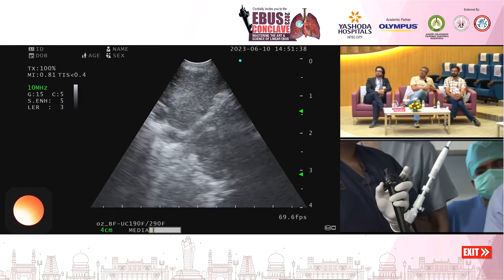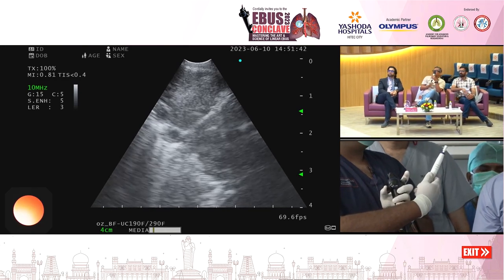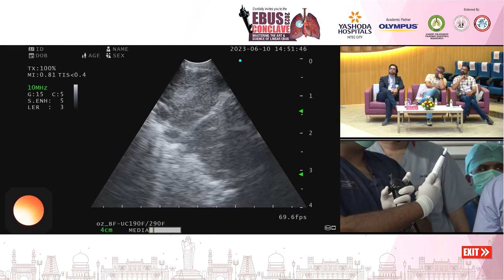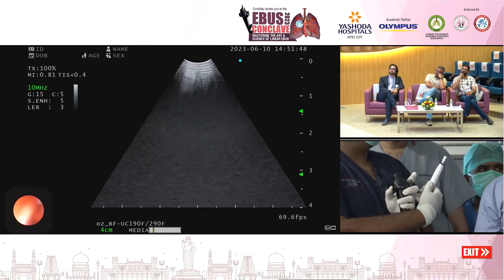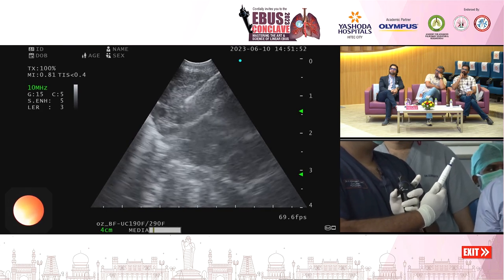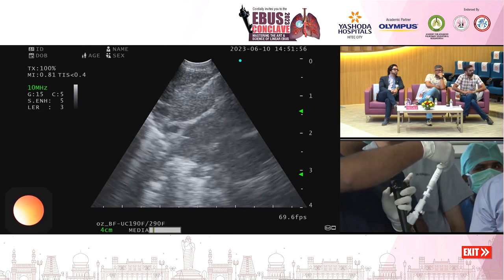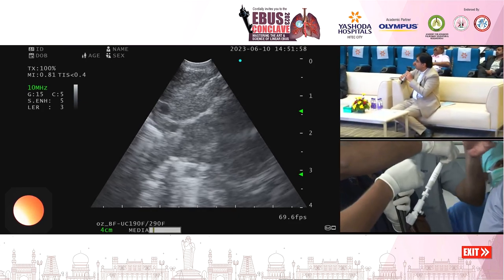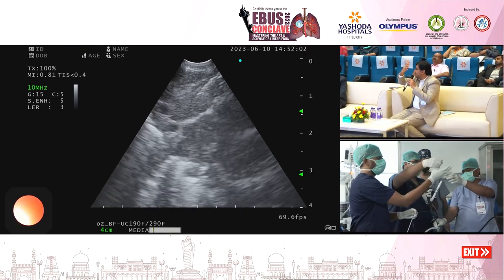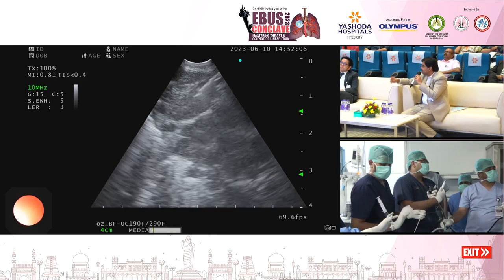So now I'm using a 19G needle here to create a tract. I'm focused on the 11L node and I've fixed the needle at about 2.5 centimeters. I've just jabbed into the node. The other thing is to get the needle in the center of the node. I think we should put the node more towards the distal part, so that it really will go in the center. What is your opinion?